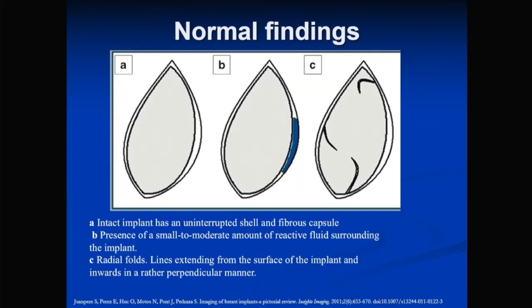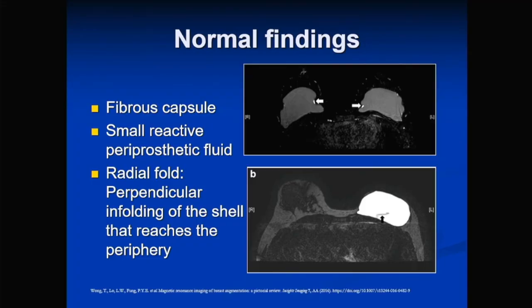Normal MRI findings: when an implant is placed, the breast forms a fibrous capsule around it. You have both the implant shell and the fibrous capsule. A small amount of fluid between the implant and fibrous capsule is normal. Radial folds are also commonly seen in normal implants — a hypointense line projecting perpendicularly from the implant shell with no fluid in between. This is just a fold and is normal, not a sign of rupture like the teardrop sign.